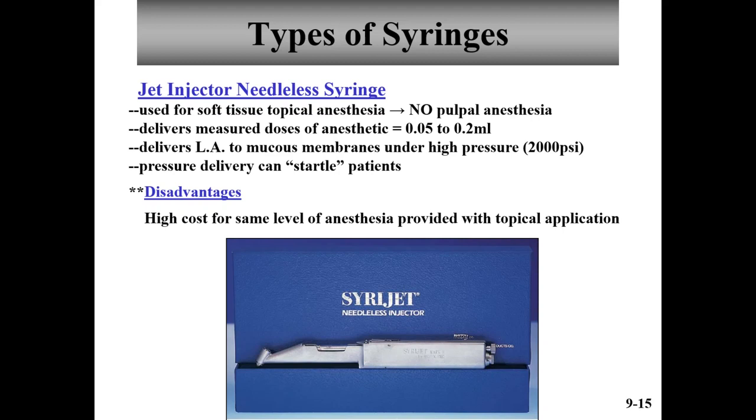that you deliver. It delivers that local anesthetic under a high pressure, and it's kind of like if you've ever heard an air compressor, the hissing sound. When you deliver the dose, it gives off that hissing sound, and there's a big puff pressure that is expelled with it up to 2,000 psi, which is a bunch. It's a lot. And oftentimes that will really startle patients. You have to give them the heads up. You're going to hear a hissing sound. You're going to feel pressure.